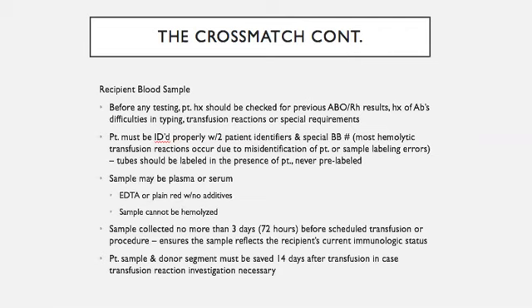So you have to save the patient's serum or plasma with the red cells and that segment. So again, it's just that sealed piece of tubing from that donor unit bag that contains a small aliquot of the donor blood. And that's what we use for testing, either in the immediate spin or antiglobulin cross-match.